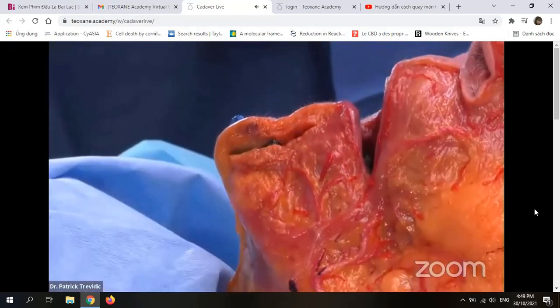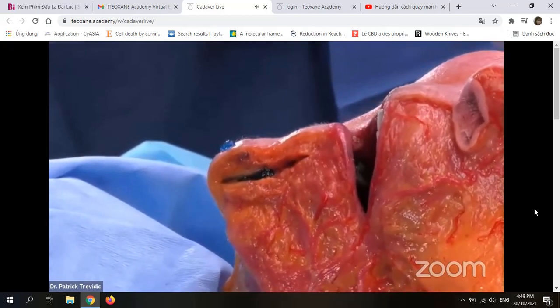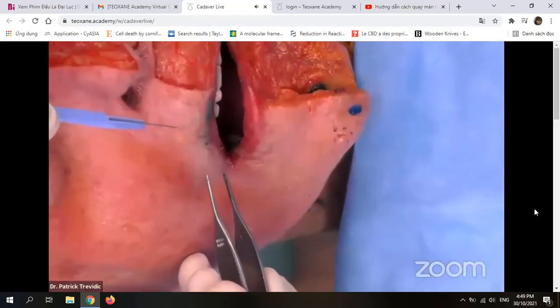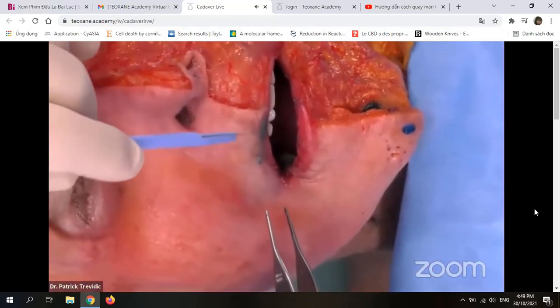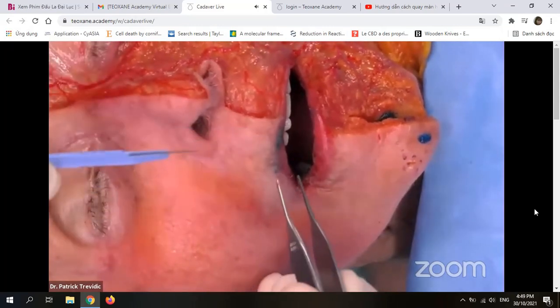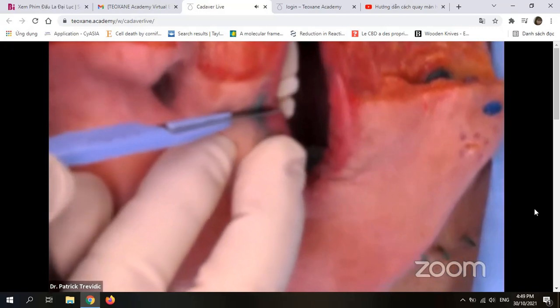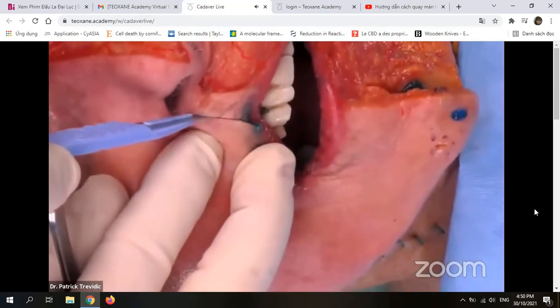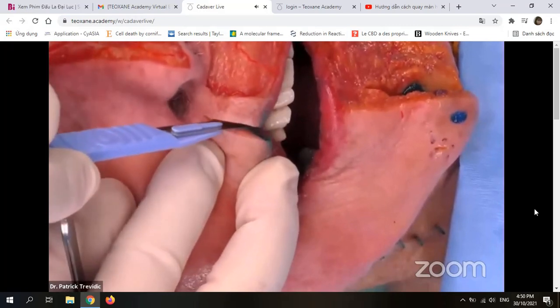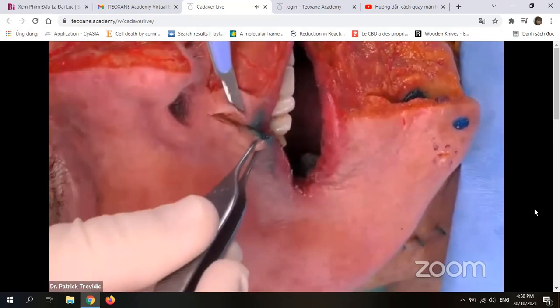Just to finish, I have 1 minute. I will go face, and we will check what happened in the lips. So if we go face, I did the injection like Nabila did it in the cupid's bow. And if I open the lips, you will discover that the HA will be superficial in the cupid's bow, in what people call the virtual canal.